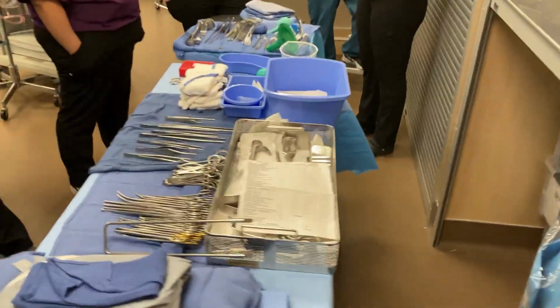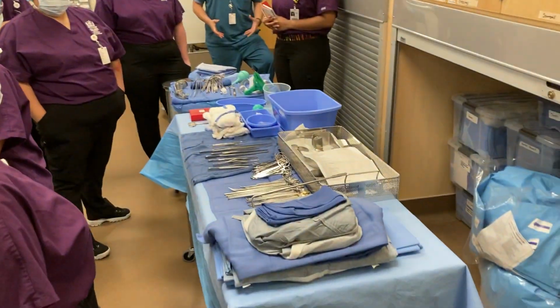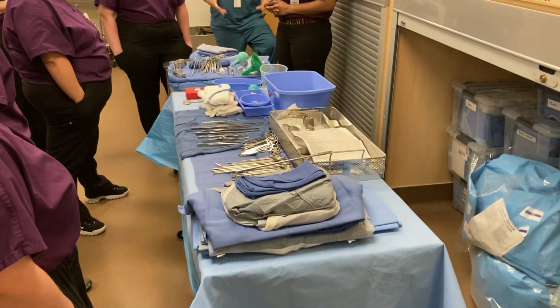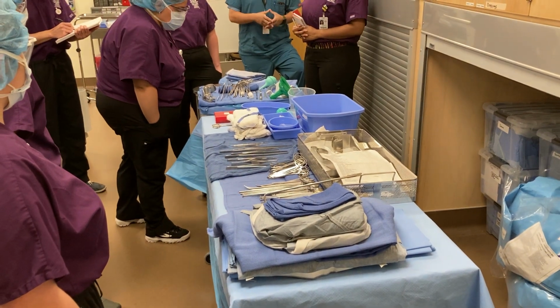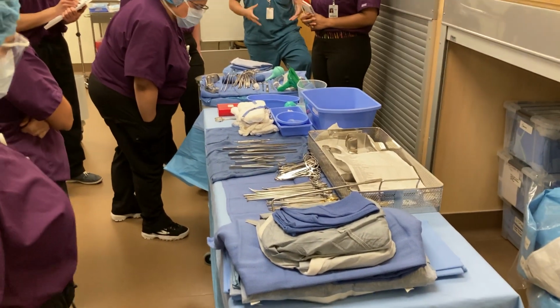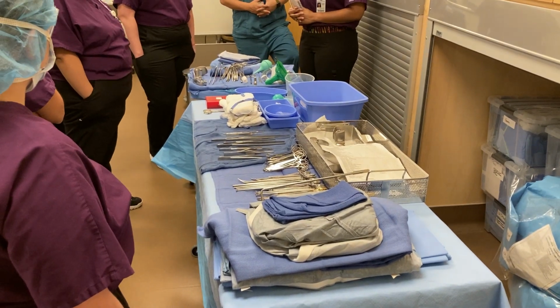So the instruments are going to be the same. Okay? We still got skin layer, subcutaneous. We still got muscles and fascia. We still have peritoneum, and we have abdominal contents. Now our instruments are basically set for the area of anatomy. In this case, the anatomy being relevant anatomy for a C-section. Okay? So let's talk about that.